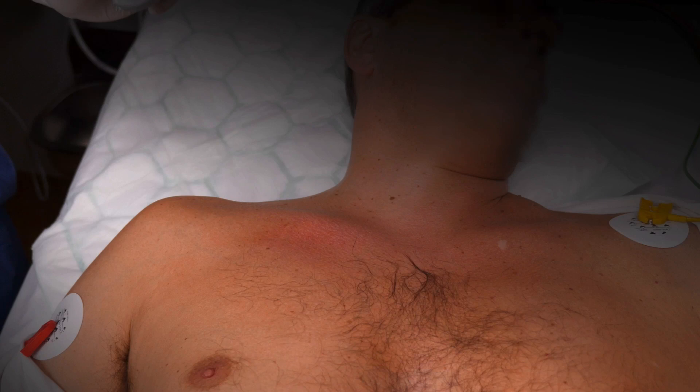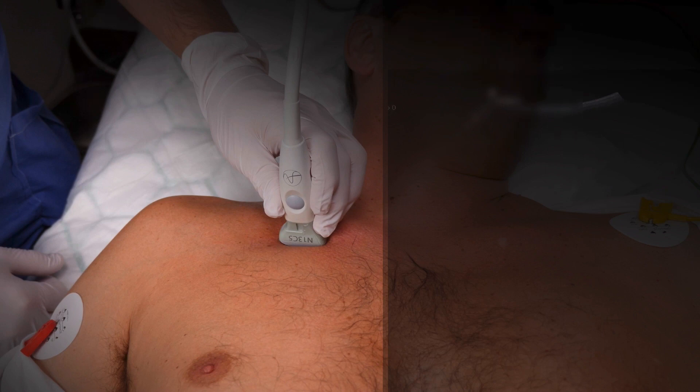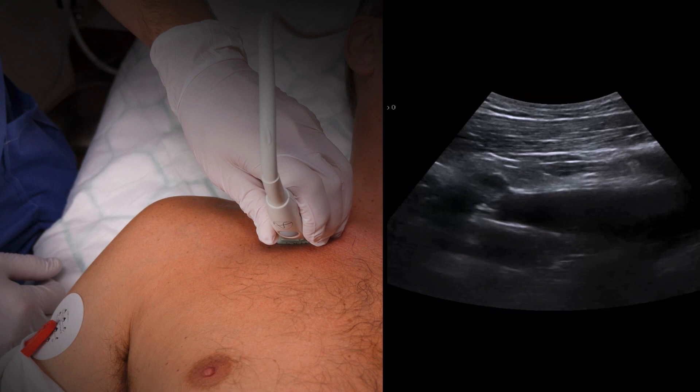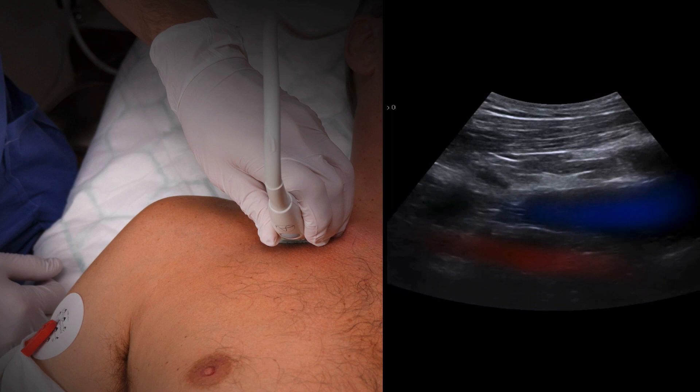Here you see the clavicle pointing slightly upwards. We place the probe 90 degrees to the sternum at the mid-clavicular level and the scanning depth is set to 5 centimeters. We then slowly tilt the ultrasound beam upwards. The more superficial vessel, that is closer to the probe, is the vein. The deeper vessel, and therefore more cranial, is the artery.